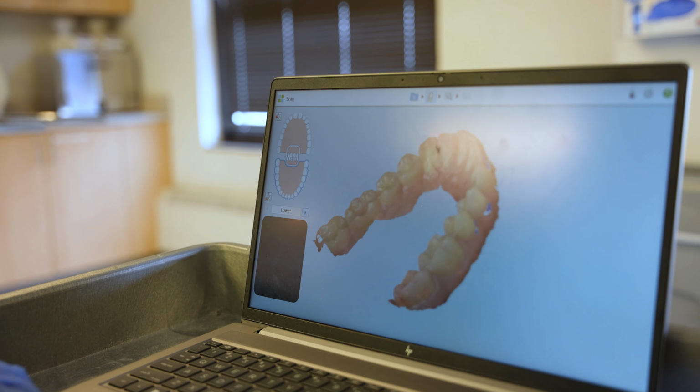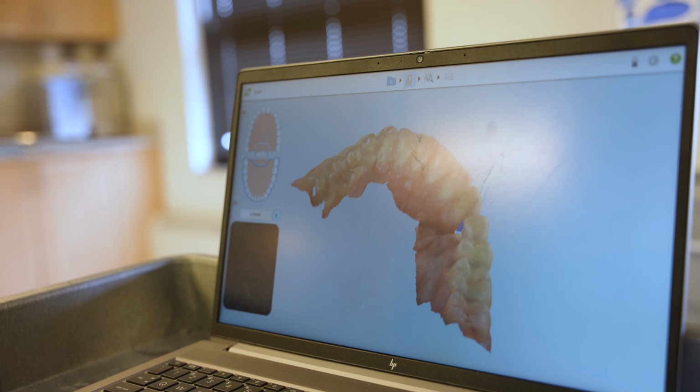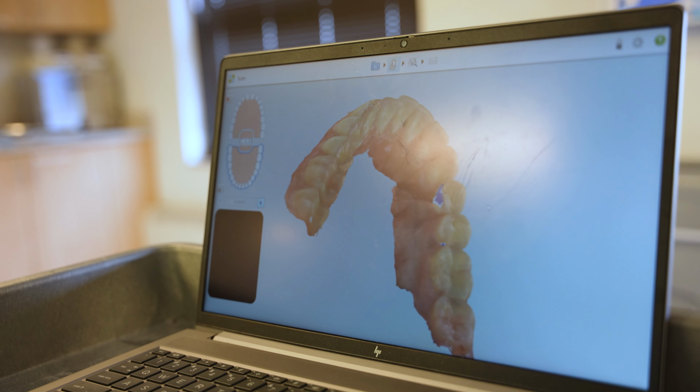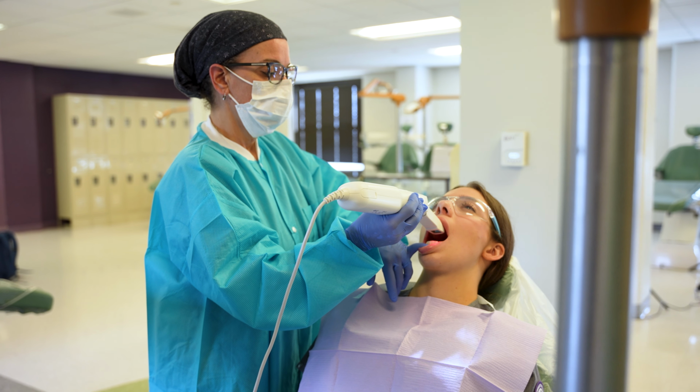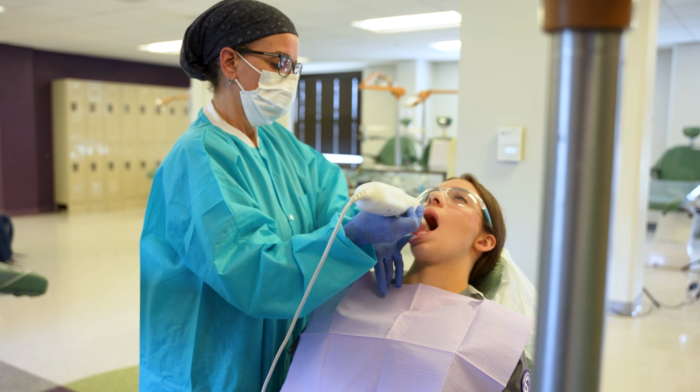It is also able to give you the depth, height, width of things as well, and it recreates a 3D image that the laboratories can use to make any number of things, from prosthesis to impression trays. Any customizable 3D printable device can be done through the intraoral scanner.